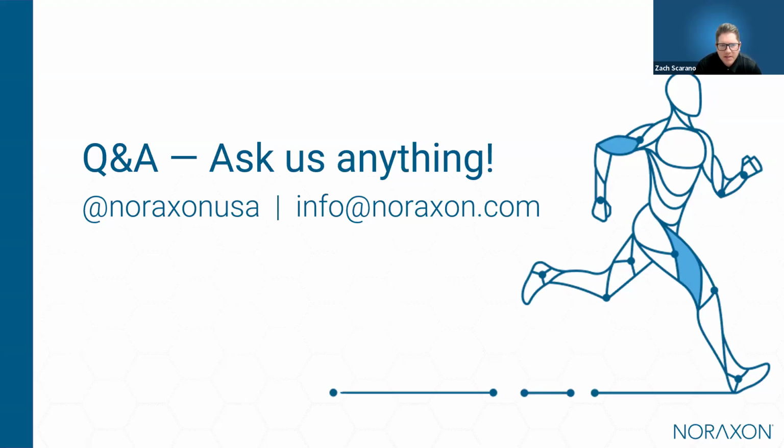Great question. This is coming in as kind of an aside here, but the question is asking if we are developing any apps that would utilize our 3D motion capture sensors with mobile devices. Of course, it's something that is on our minds. Nothing that I can share at this point. But that's a clear use case, being able to utilize the inertial sensors to deliver information, whether it be about kinematic biofeedback or even some of the other routines that we have embedded inside of the MR software for doing different activity detection and so on. But yeah, thank you for your question.